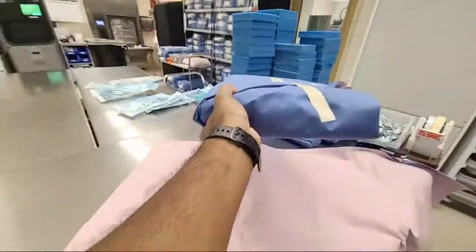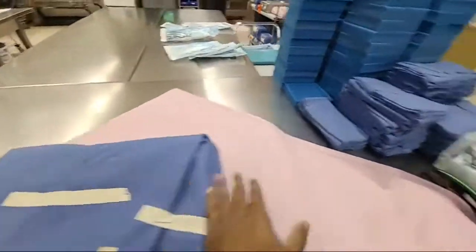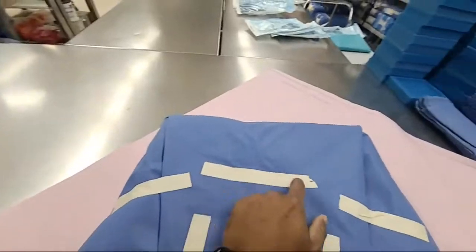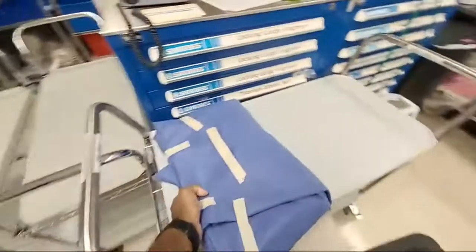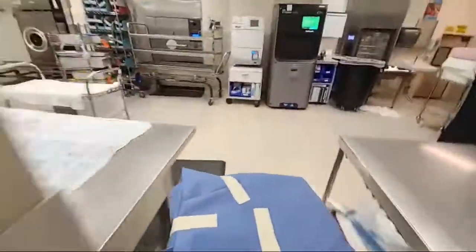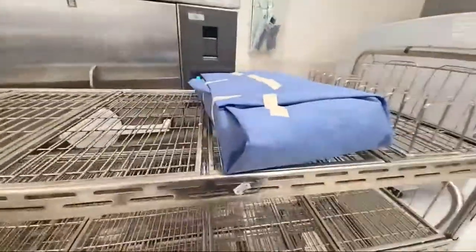If it was a loaner, we'd put it on the side because usually we stock these like this, so we'd see it like that. And then on the top, we'd write the item information, and then our initials. And we'd take it and set it right here and continue wrapping. Otherwise, it goes straight onto the steam cart, like that.